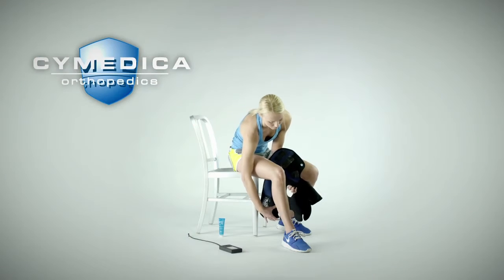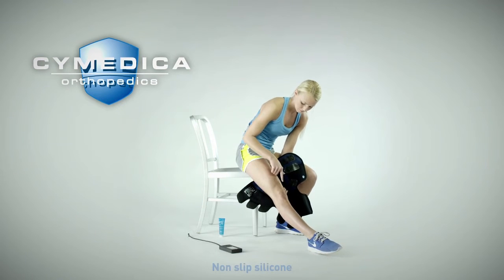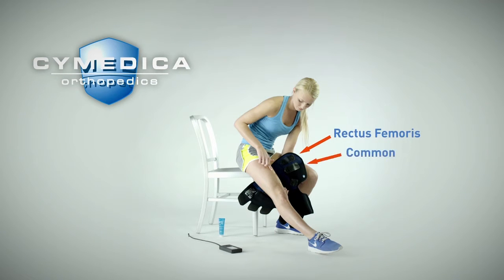Take the conductive garment out of the box and sit on the floor or a chair with the injured leg extended. Place the garment underneath the leg with the hole position behind the knee and the blue surface under the thigh. Wrap the garment around the top of the thigh starting with the inside thigh panel. Three NMES electrodes are used in the conductive garment: the rectus femoris, common and vastus medialis or VMO, and are pre-positioned on the inside thigh panel. During the initial fitting, make sure that the electrodes are properly positioned for your leg anatomy.